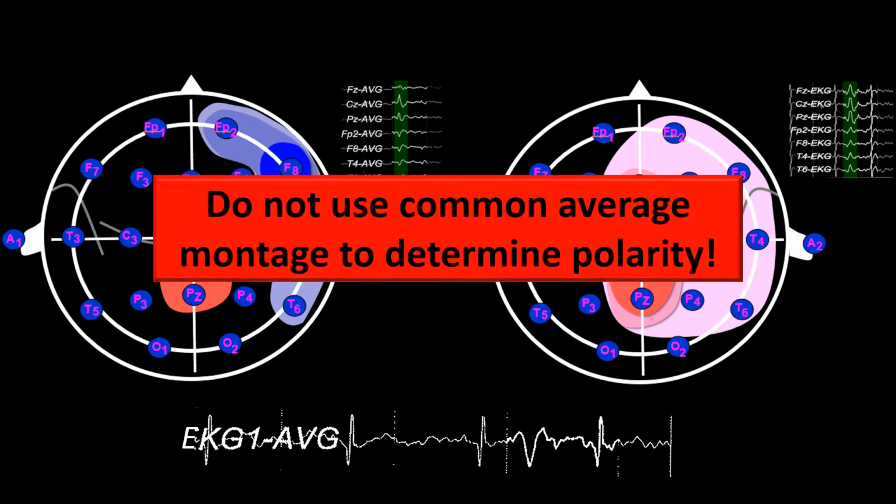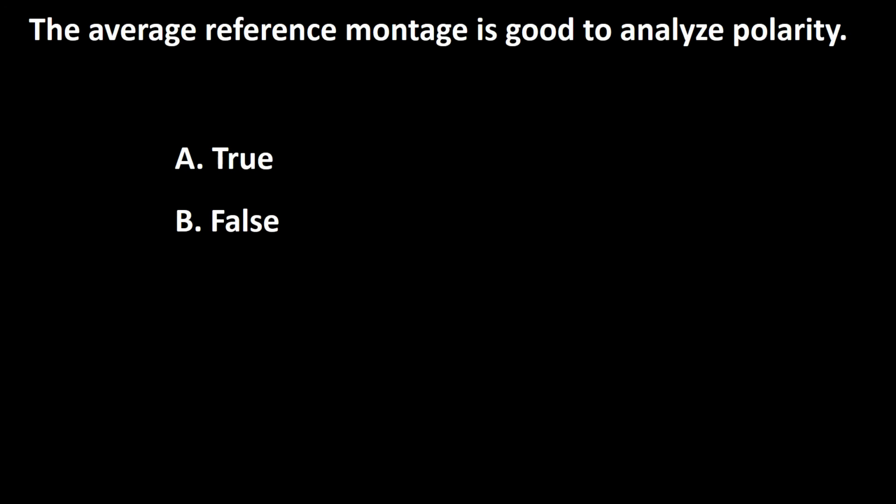The moral of the story is not to use average reference montage to determine polarity or to draw an isopotential map. So the answer to this question is false.